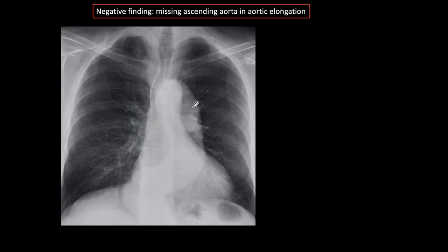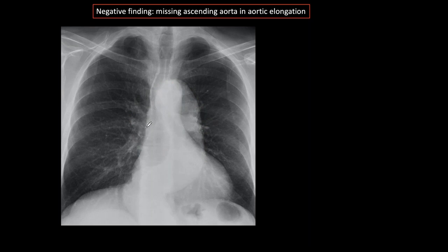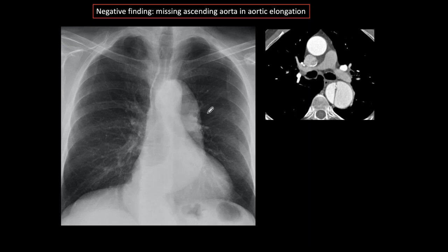A very important negative finding, which I call the 'missing ascending aorta in aortic elongation': when the aorta elongates, the whole aorta is supposed to be elongated. In this case, we only have the descending aorta visible and we don't have the ascending aorta. When you see this combination — no ascending aorta and a dilated descending aorta — you have to suspect a type B dissection on the plain film. Not all the time will you be right, but I would say 50% of the time you will be able to make the diagnosis and confirm it with CT.